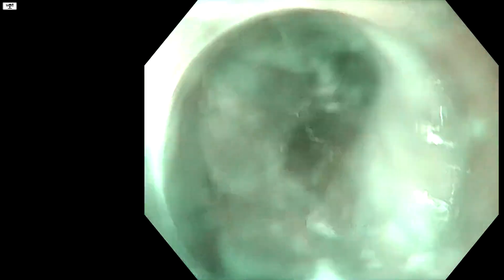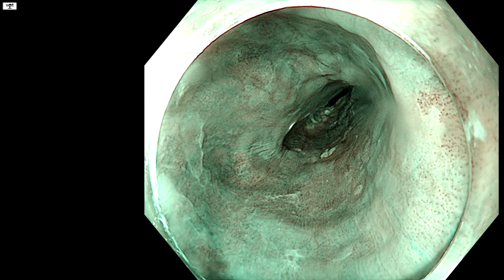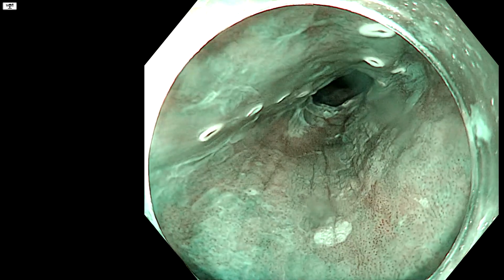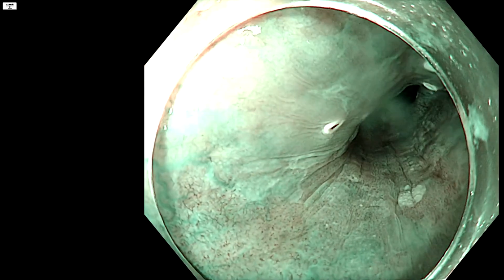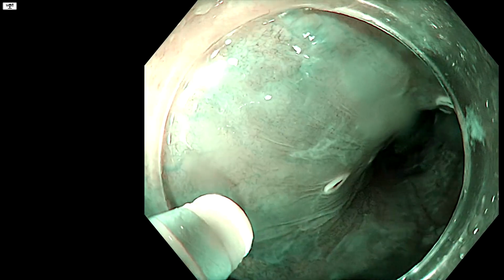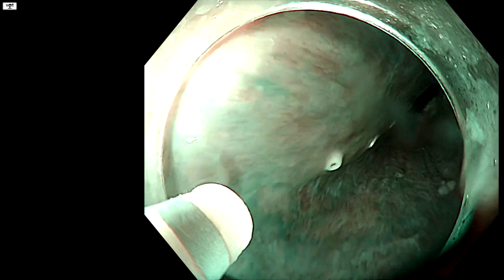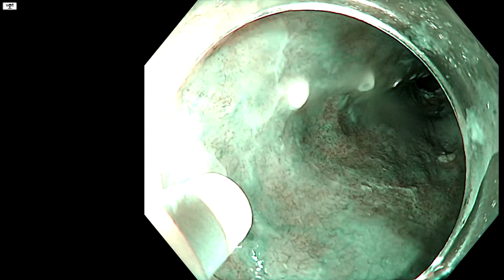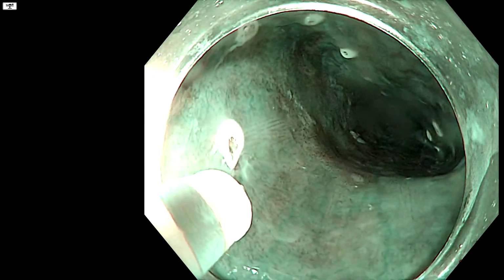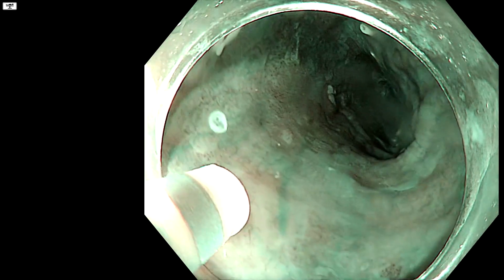But yeah, when you look at this from afar, then maybe we think that the thing ends now about 2 centimeters away from the endoscope. And I think this is probably something that we would do stage. So I will mark here now, and then we will apply iodine, and we'll see what that also gives. It can be very difficult, and I think that is nicely demonstrated here. Okay. You can see the pattern is very different just where the knife is to where it's off it.